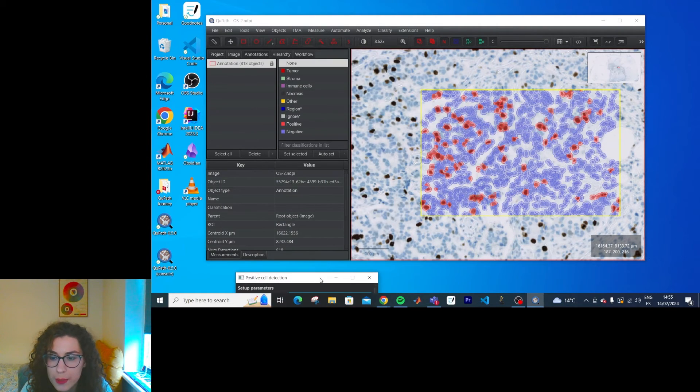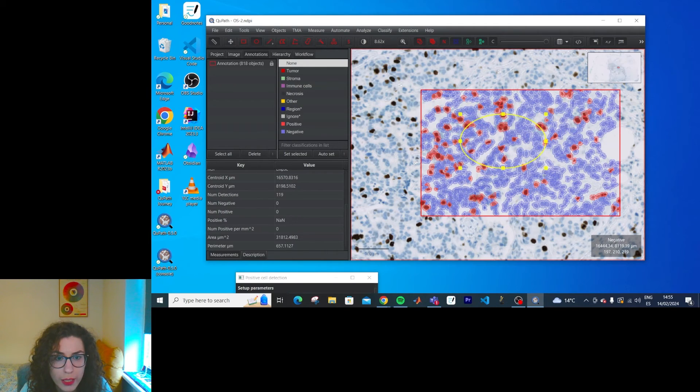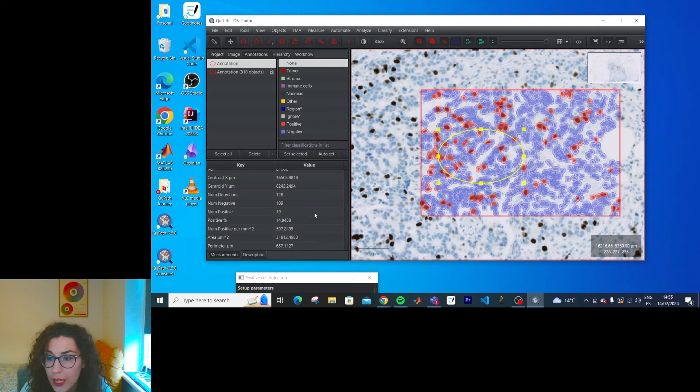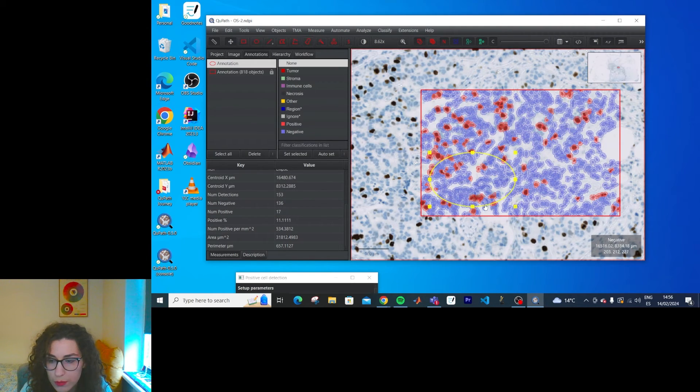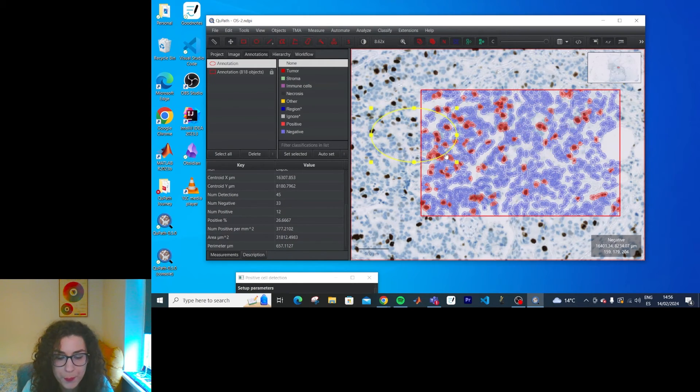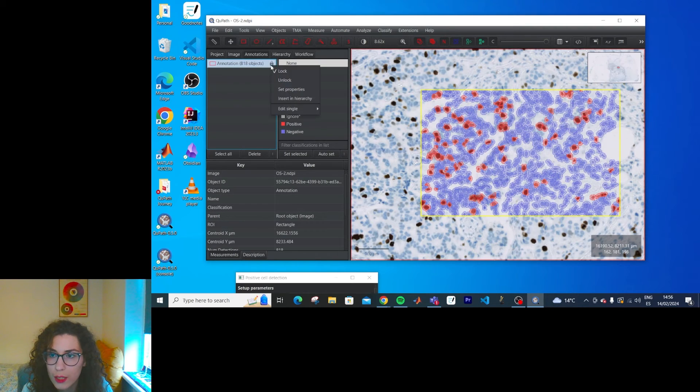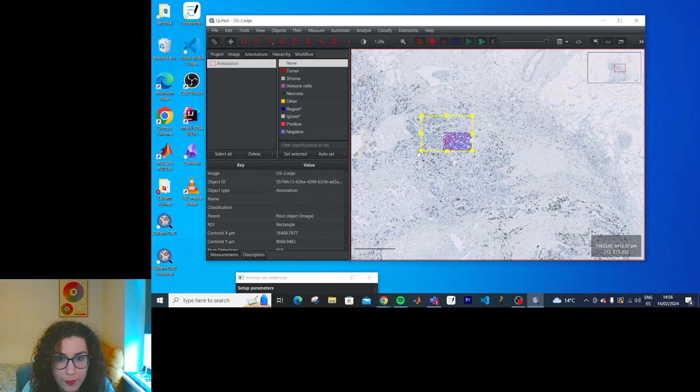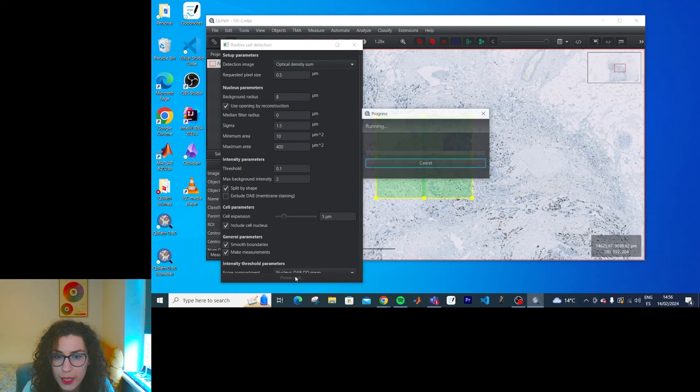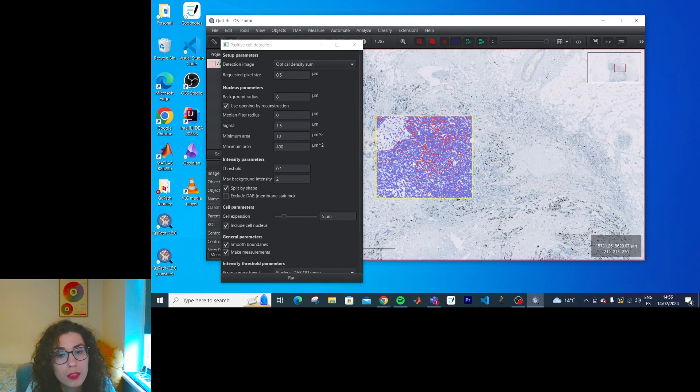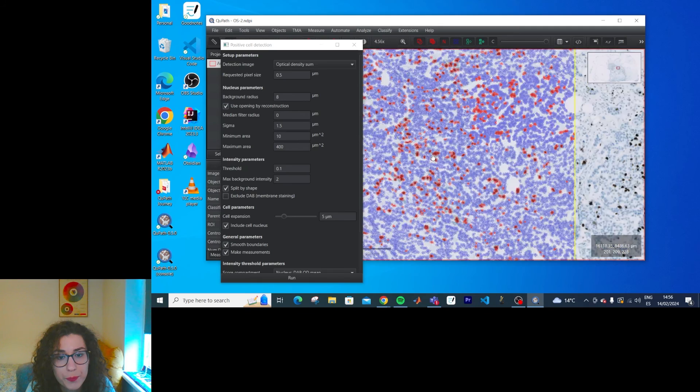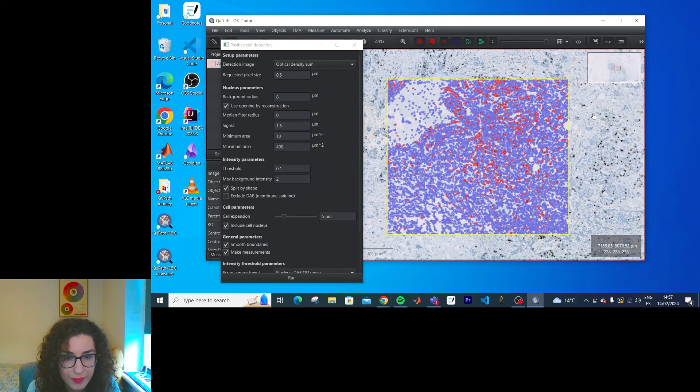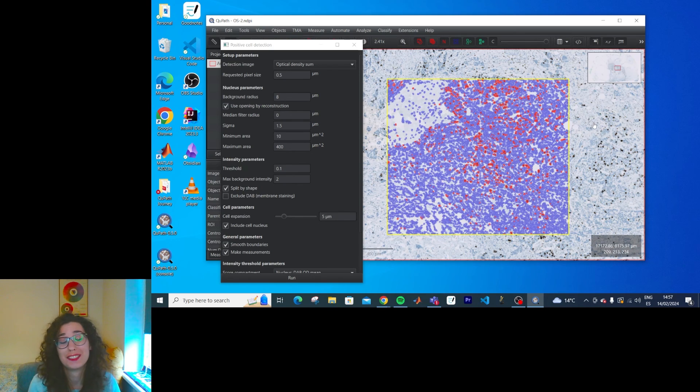And now what happens if I create an annotation on top of this one? Like this. Does this change? It does change. It's just not live. You have to drop it for this to refresh. Useful as well. And what if I unlock this one and I increase the size? Nothing. Do I have to run it again? Yeah. And it's divided it into tiles. I need to play with this a bit more to truly be comfortable with it. But I think I understand it. Hopefully you have understood it too and have learned something with me.